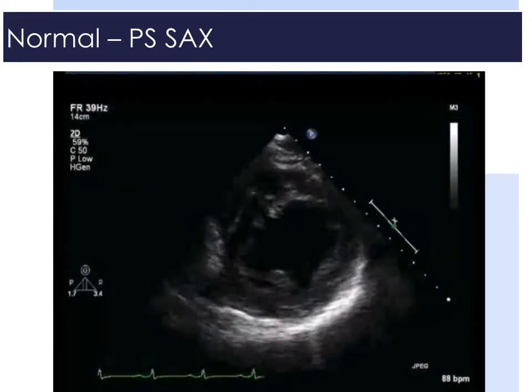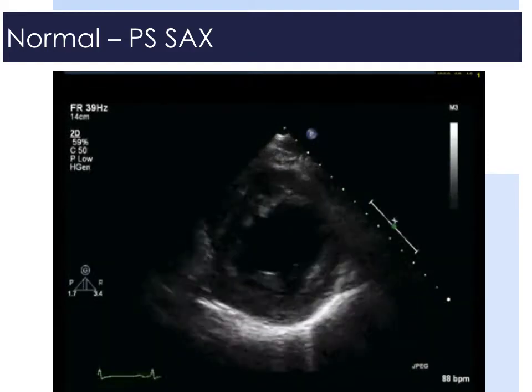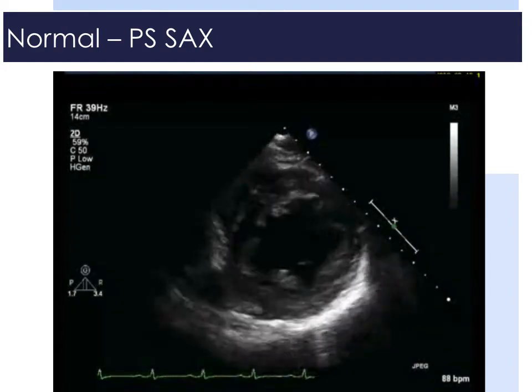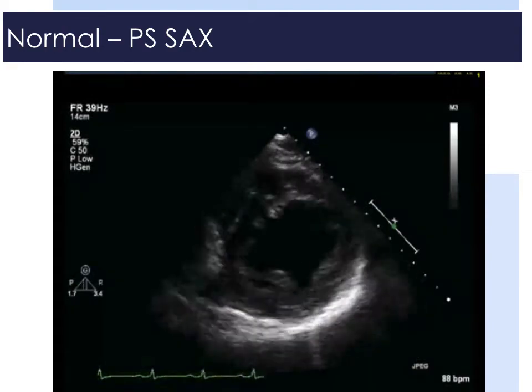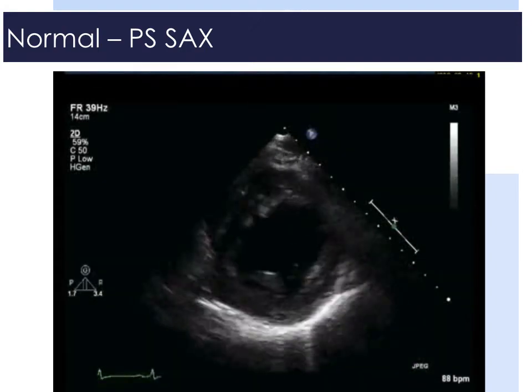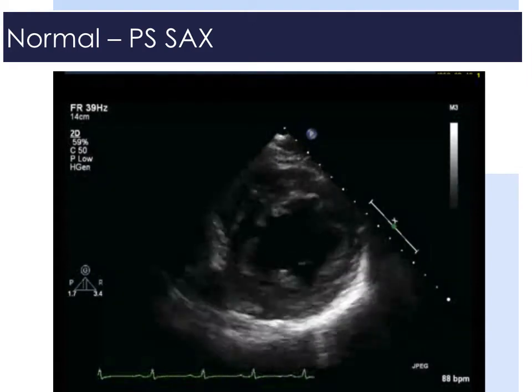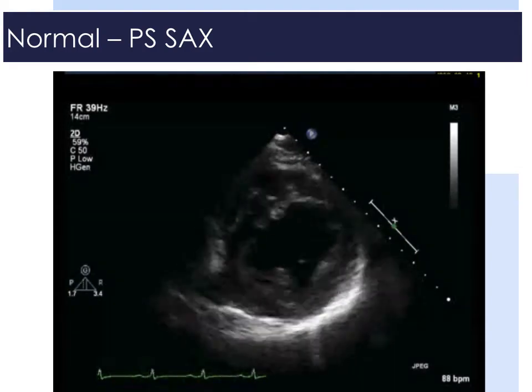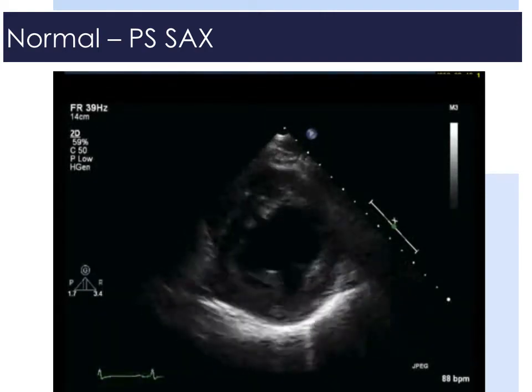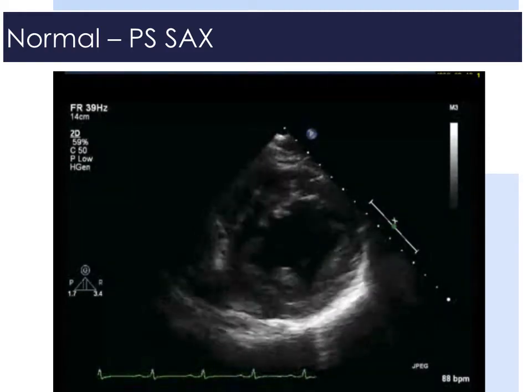We can perform a similar judgment on the parasternal short axis view. On this view, the left ventricle is dominant and well visualized. Although we visualize only a slice of the heart, we can appreciate all 6 segments, with the anterior portion on the superior part of the screen, and the inferior, lateral and septal segments. It is good to orient yourself in understanding what is anterior and inferior from what is lateral and septal.